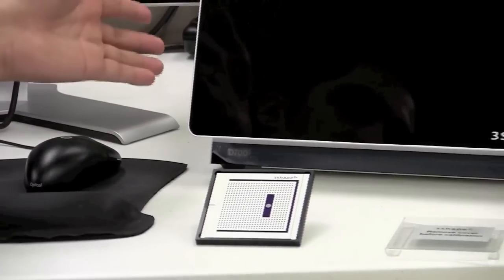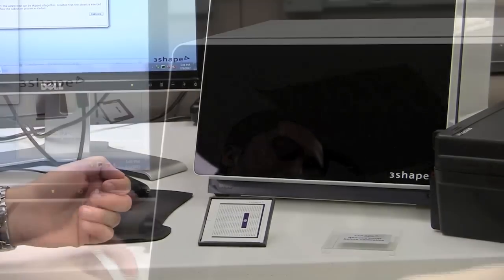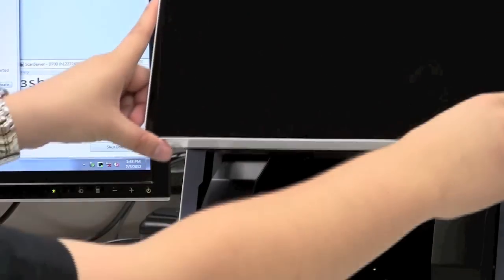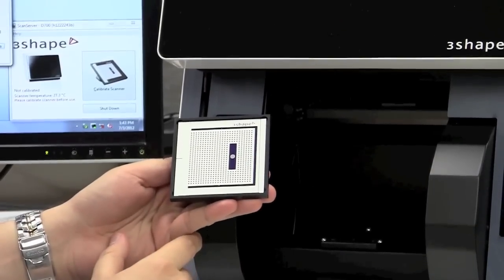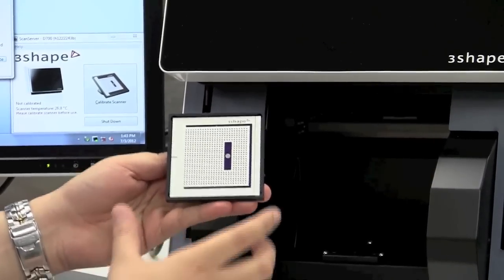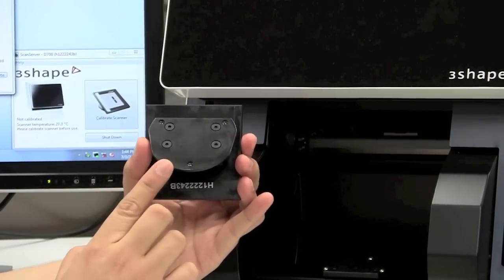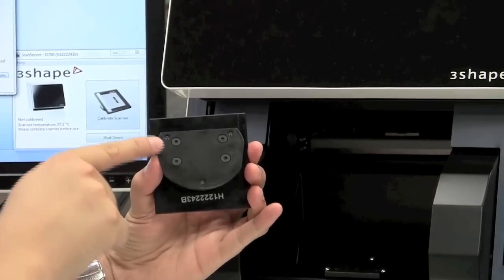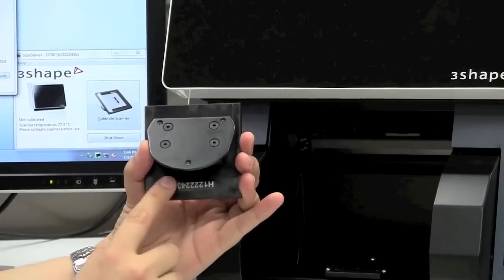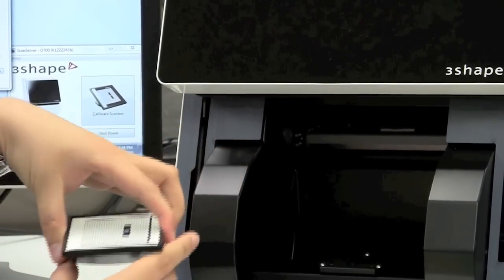According to the instructions, what we need to do next is open up the scanner and place the calibration object inside. As we open the door, I want to take a second to show you some things about how this calibration item and the scanning plates are going to sit in the scanner. If we flip the calibration item upside down, we can see that on the bottom there are three grooves in the shape of a triangle — one here, one here, and one here.